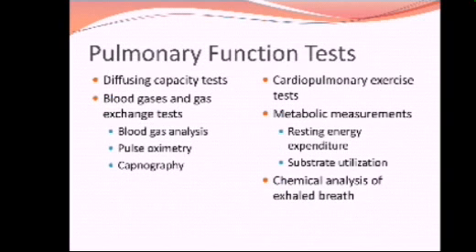Then there are diffusion capacity tests, blood gas and gas exchange tests. Cardiopulmonary exercise tests could be done. We can also perform metabolic measurements where we can see the resting energy expenditure and the chemical analysis of exhaled breath.